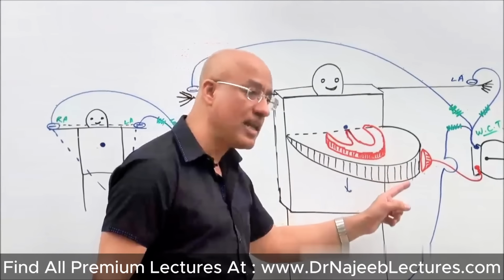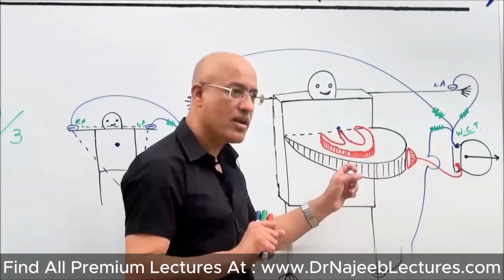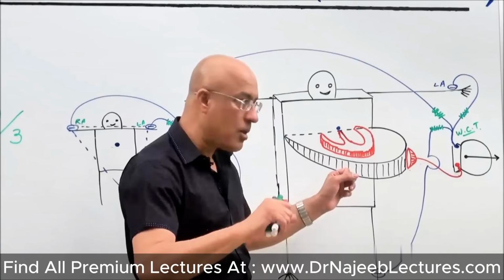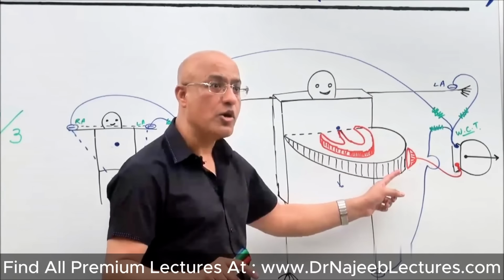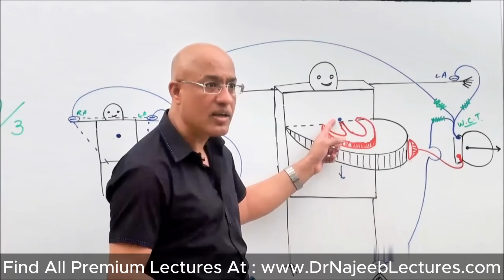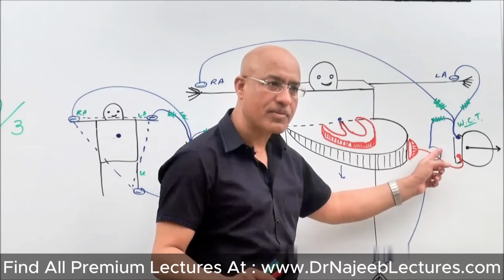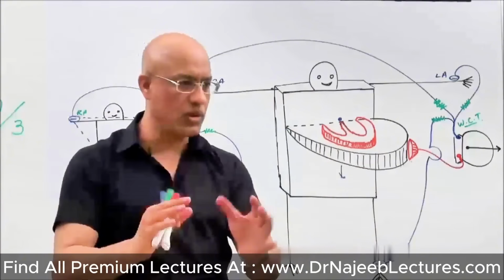The function of the chest leads is to determine the electrical activity of the heart transmitted along the horizontal plane, by applying the exploring electrode on the surface of the chest and making the indifferent electrode in the center of the heart by the formation of the Wilson central terminal applied on the negative pole of the machine. Is that clear? Now let's define it once and for all.